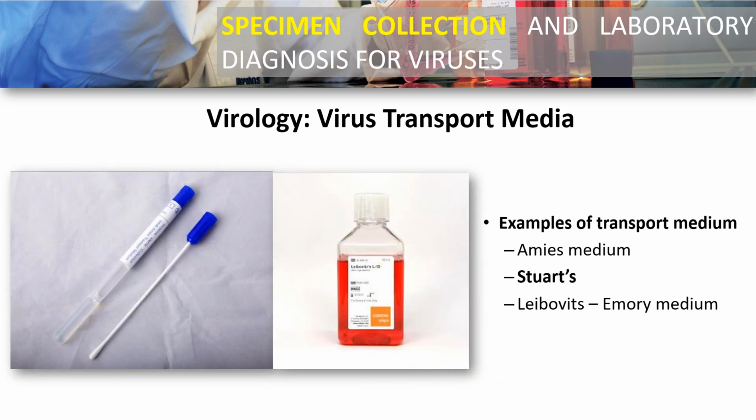Example of your transport media naman, class, we have your Amies medium, Stuart's, at saka Liebovitz-Emory medium. So, ito yung tatlo yung pinaka usual na ginagamit, class. Pero yung recommended naman, class, you have your Stuart's. Narinig na, diba? Kaya narinig na natin to sa bacteriology. Pwede naman natin gamitin yung transport media na Stuart's na ginagamit natin sa bacteriology to collect your virus.